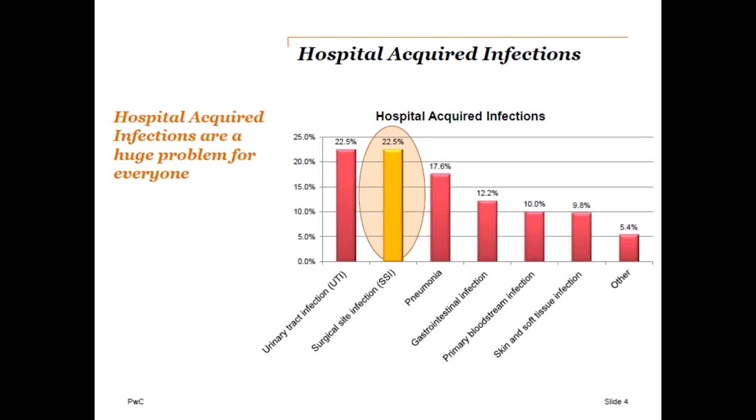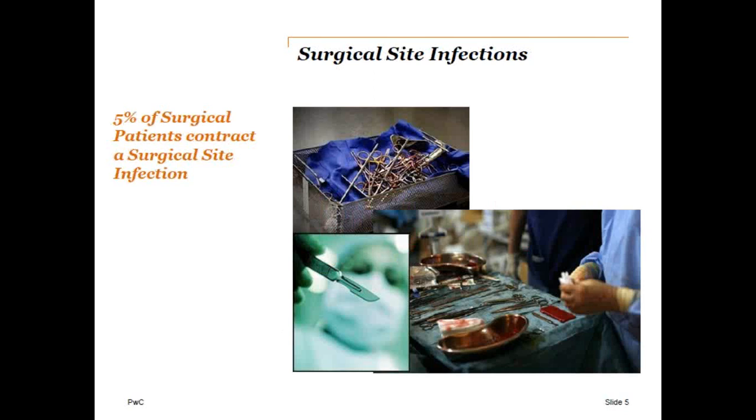Surgical site infections can occur as a result of an inadequate sterilization process, but they can also result from not having a traceability solution in place. So in 2002, a patient in the UK walked into a hospital with CJD. This is more commonly known as mad cow disease. This patient underwent surgery in the hospital, and it was only discovered during the brain biopsy that the patient had CJD, at which point the surgical instruments were back in circulation in the hospital.